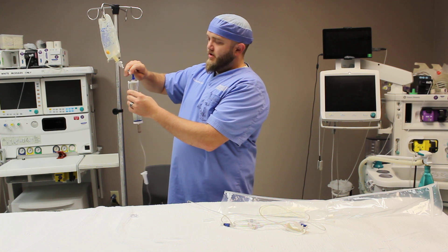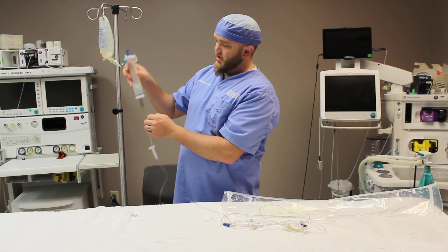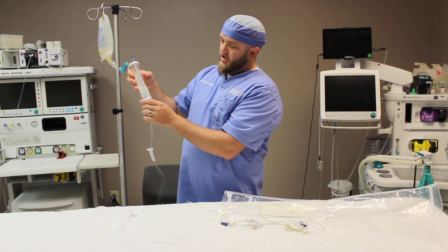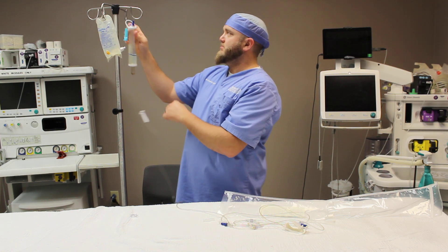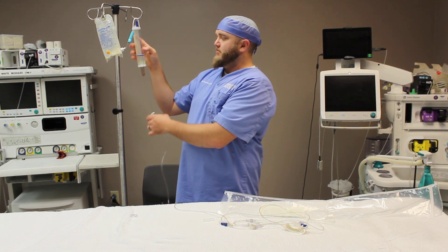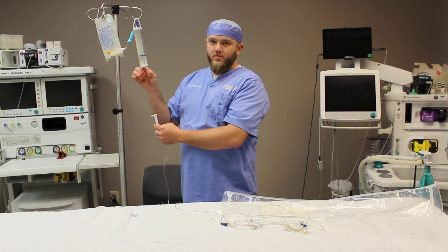We're going to close that on-off lever — we still have the airway lever open. You're going to have to shake it, as you can see here, because it doesn't want to float. Now you have the little measurement. We're going to hang that up there just like that, and you want to squeeze the drip chamber until it's about two-thirds full.